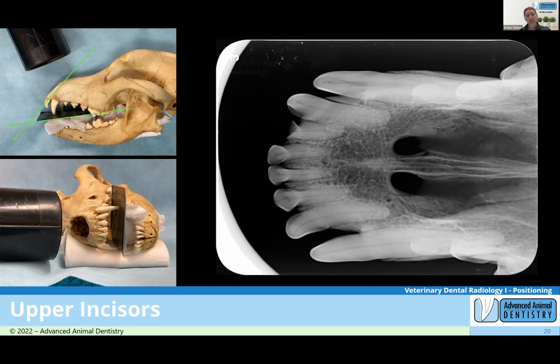This is also where I said we don't want to look at the angle of the crown, because that's straight up and down. We want to look at the angle of the root, which is basically traveling in this direction. You have to take the average of it, because all those roots curve. There are 6 roots there, and each pair is probably in the same plane, but they're not all equal. So let's take an average of them, and this is the image that we can observe.